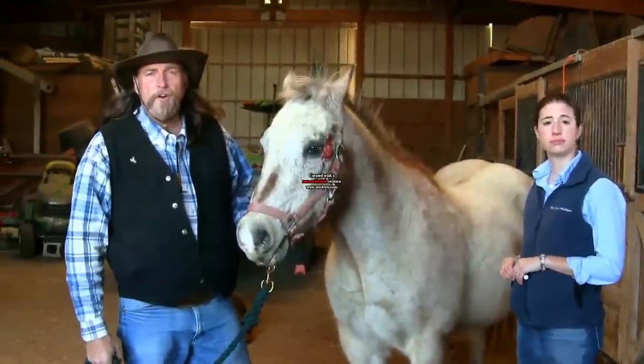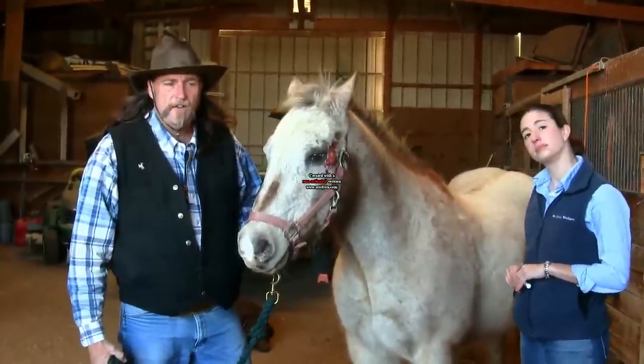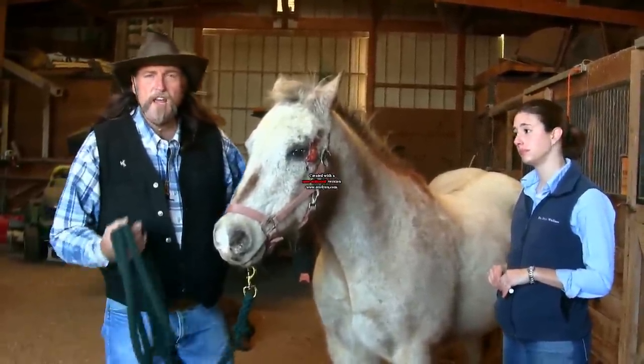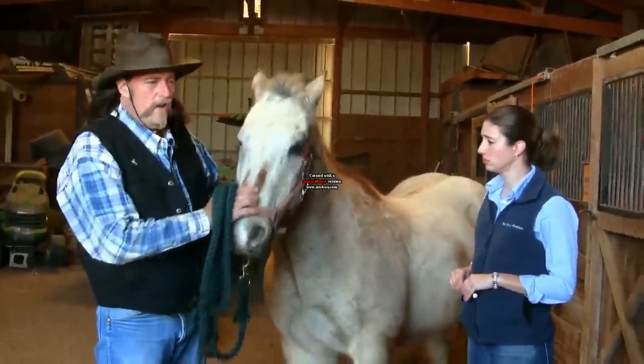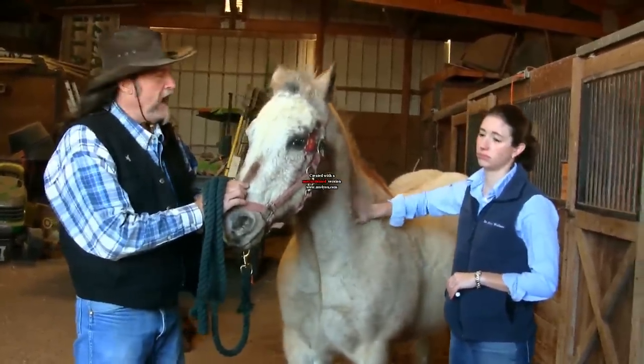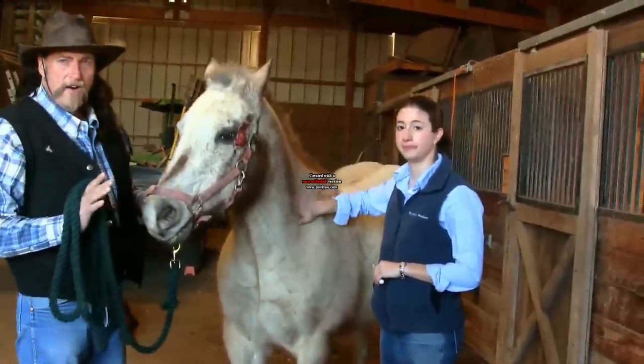Hi folks, welcome to another stall13.com video. A lot of you have never seen a horse get an injection. What we're going to do for the sake of your education is inject this horse with something that is sterile and passive — we're using sterile water. It's not going to hurt him.